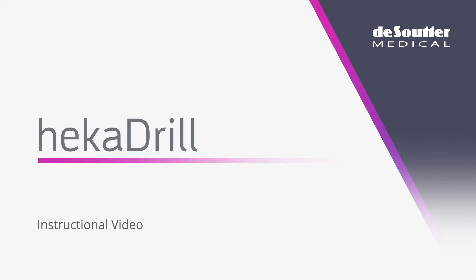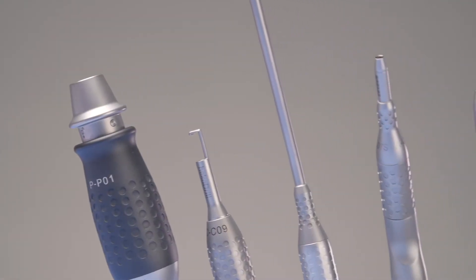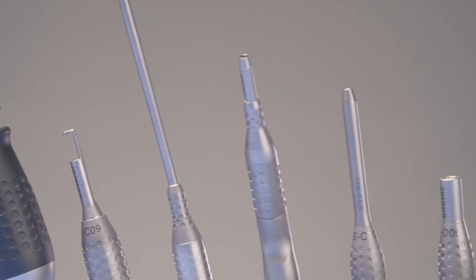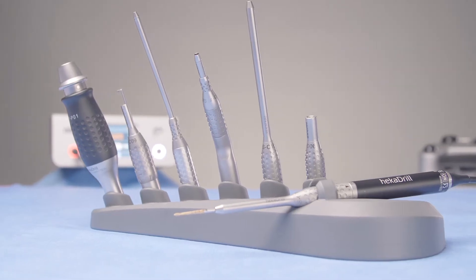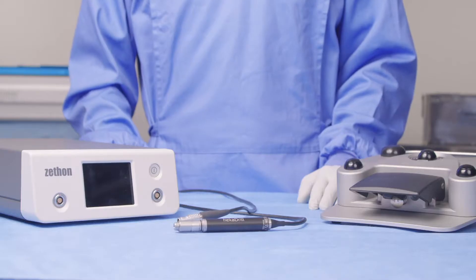Hello and welcome to this instructional video for the Heka Drill high speed system. This high speed system is designed for delicate bone dissection and the most demanding spinal, neuro, and ENT procedures. We have electric and pneumatic handpieces available, both of which are modular. Today I'm going to show you how to work with the electric system.